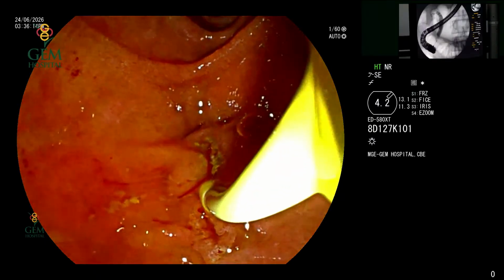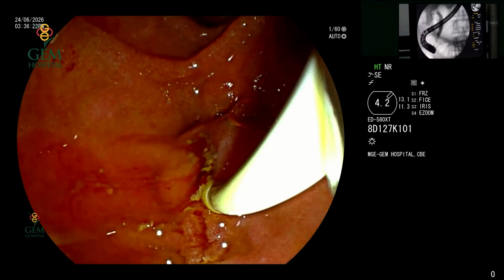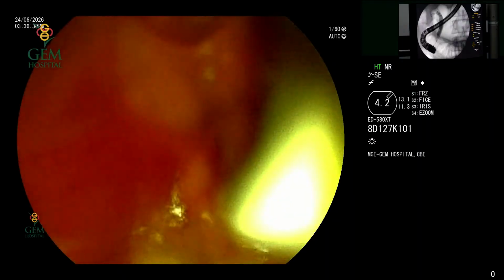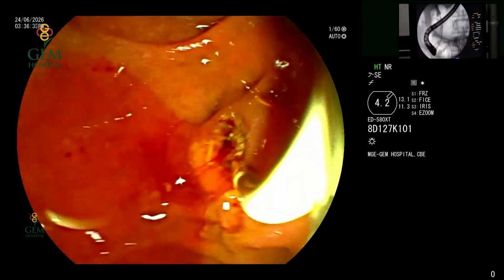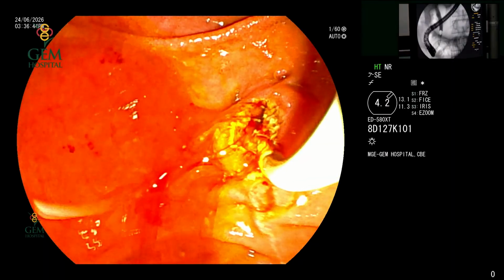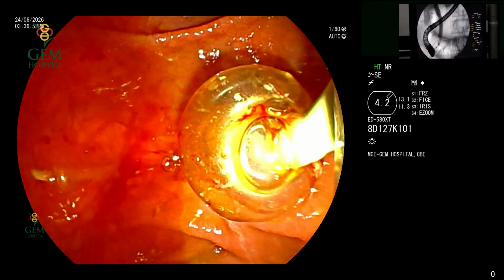We will be proceeding with the check cholangiogram once the biliary system is cleared. The endoscopist will have a feeling of clearance of the CBD as the balloon moves inside and out. When we have a residual stone, mostly we'll feel a resistance while we navigate the balloon above. So we are proceeding with the check cholangiogram. As you notice, the baseline was a clear cholangiogram where the contrast has drained. Now we are re-injecting the contrast. We still can see a dilated biliary system, but with no obvious filling defect till the mid CBD. We are proceeding even further. The balloon has come out.